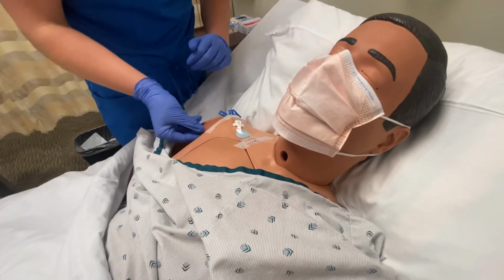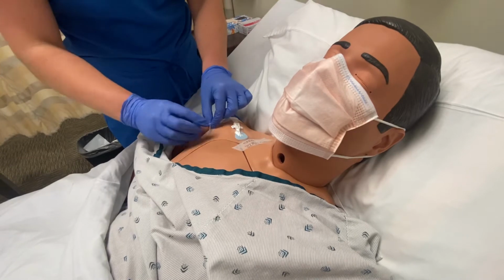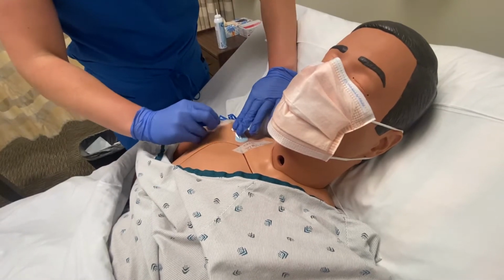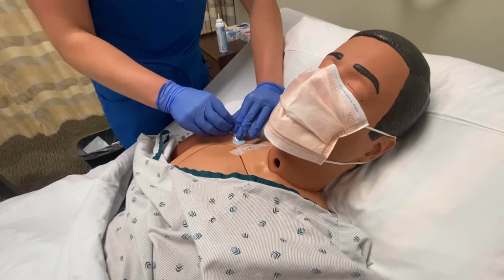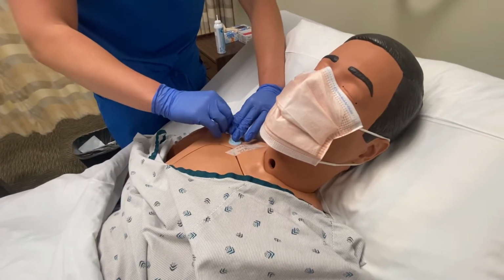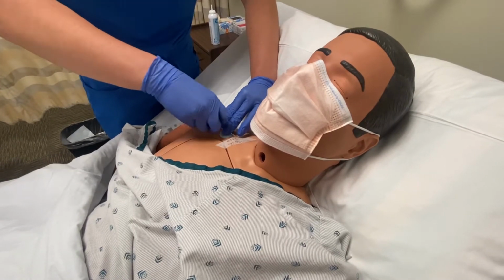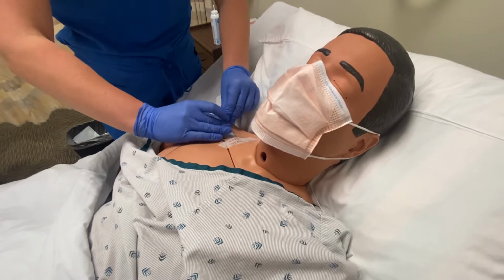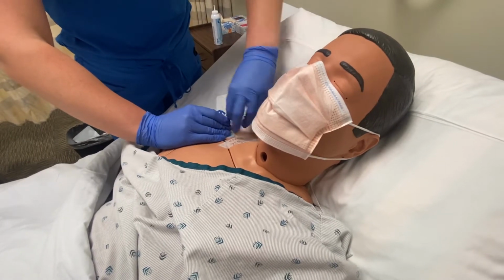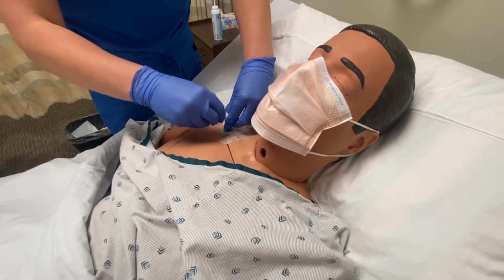So now I'm just going to go ahead and remove this old dressing. You're going to feel a little bit of a pull when I take this tape off. So I'm sorry, kind of like a band-aid coming off. Okay. So we're going to start from this end and pull forward so that we don't dislodge that line at all, and I'm stabilizing it with my other hand. Again, sorry about the little pulling. We just want to be really careful that we don't move or dislodge this catheter during the process, okay? Okay.